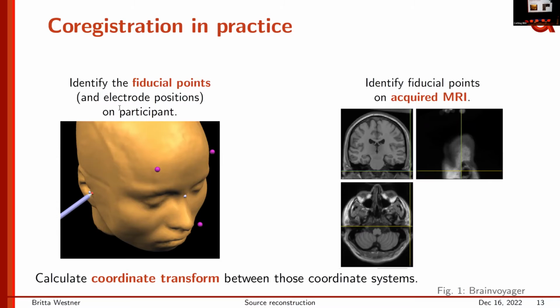Just to also appreciate that point with MEG, we have in this case the upside that our sensor positions are fixed in the helmet, so they will not move relative to each other, which of course with an EEG cap, they do. For each participant, the relative position of one electrode to another will be slightly different because you try to get that cap as closely to the head as possible.